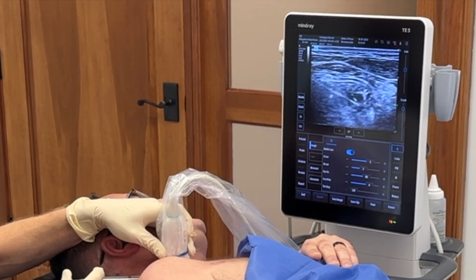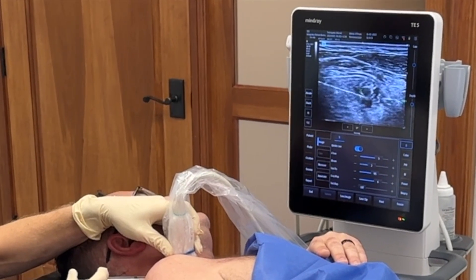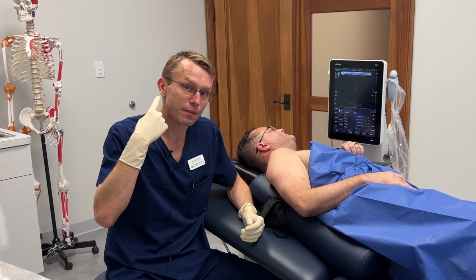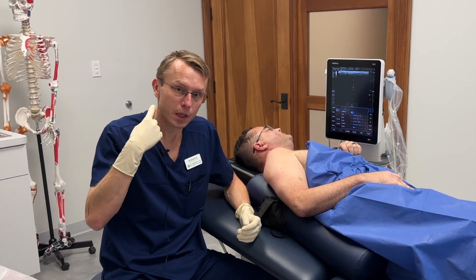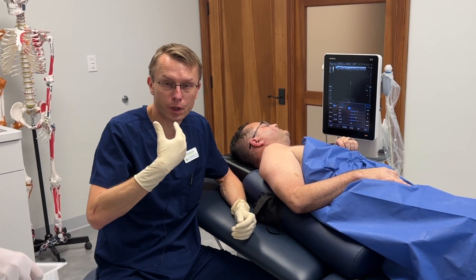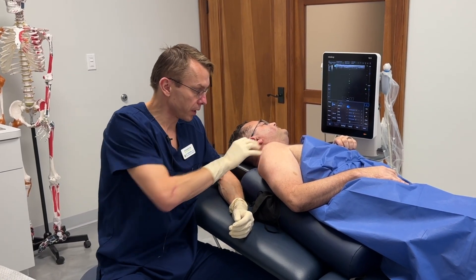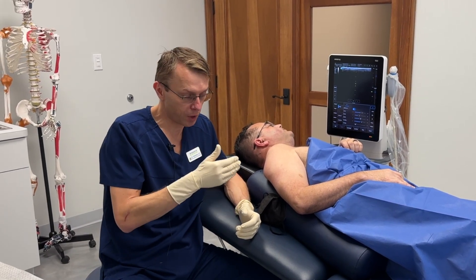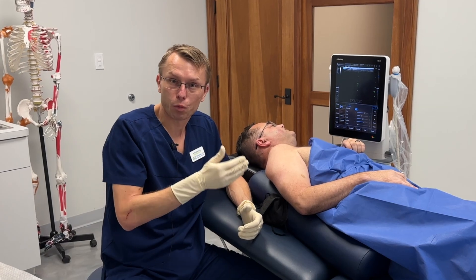Doing okay? Yes. And there we go. So we are done with the nerve hydrodissection. I hydrodissected the C5 and the C6 nerve root, and I also treated the brachial plexus. That should give him some improvement of the nerve function to his deltoid and his shoulder muscles. So we're going to see over the next couple of weeks how he does, and we're going to probably do a couple more treatments and we'll follow his progress.